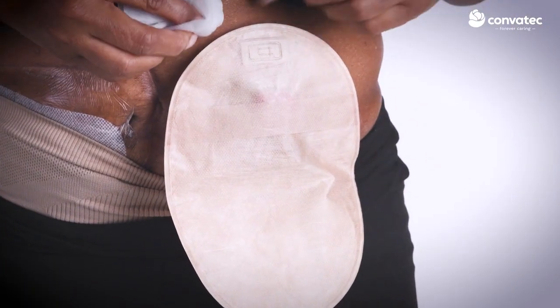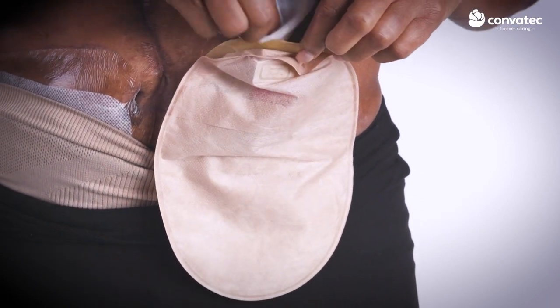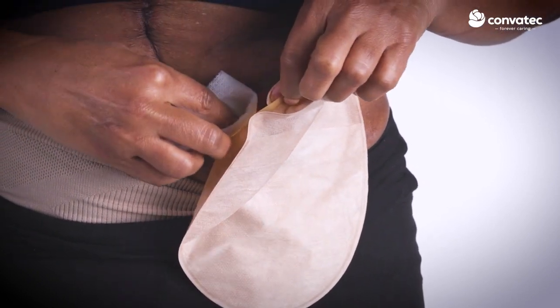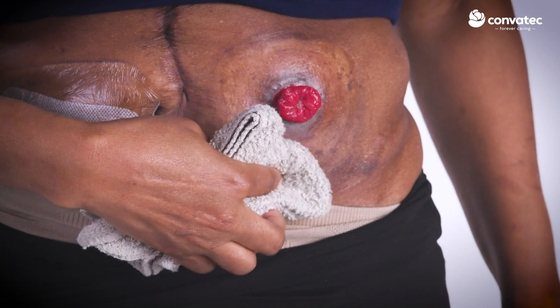Now carefully remove the system you're wearing. To remove the old adhesive, wipe an adhesive remover wipe at the edge of the base plate. Gently lift the base plate while wiping and pressing down on the skin as you lift. An adhesive remover spray may also be used. Wash the skin with water and pat dry.